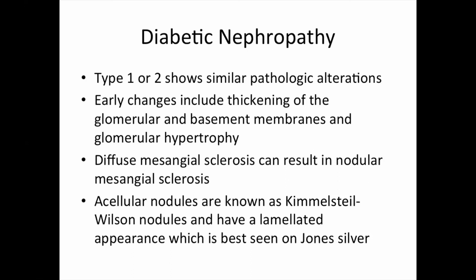And we will have IgG as well as C3 present. But what we will have in diabetes is basically an accentuation, as if somebody took a pen and outlined the glomerular basement membrane. This is because it is thickened. But it will not be bright. It won't be bright. And honestly, guys, you will have to see it in real life cases to appreciate it.